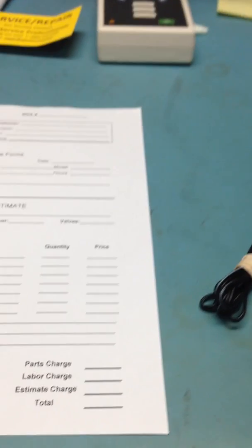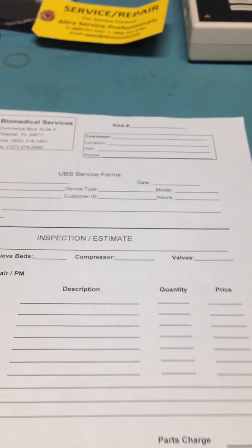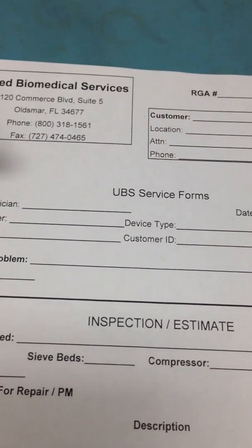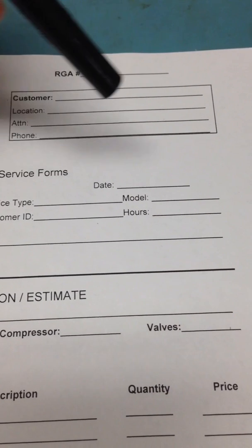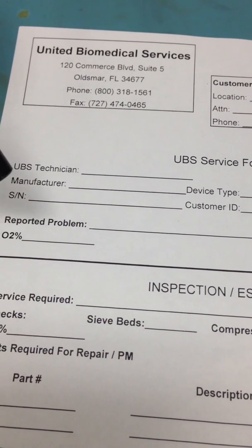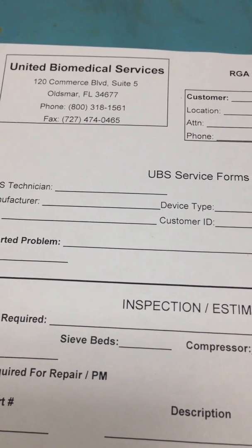This is part one of a preventative maintenance on a feeding pump. This is the service form from the manufacturer — the device type, the model — and we usually fill in the serial number to identify the medical device.